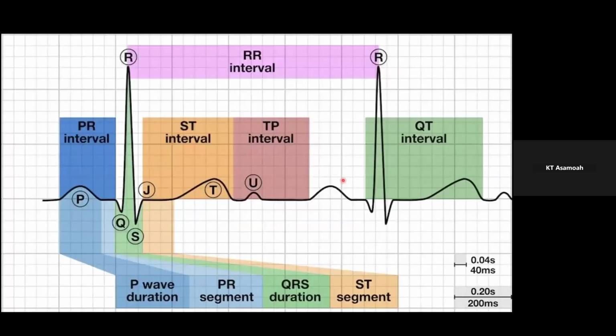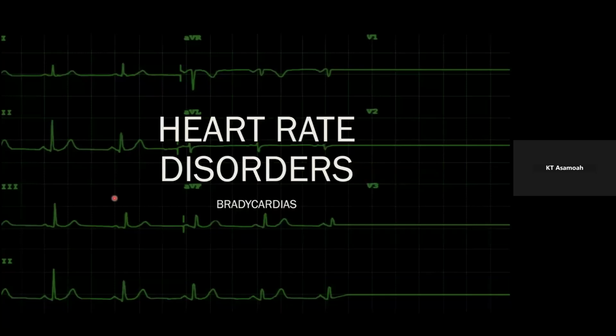And then there's a prototype ECG. I believe we all know what the intervals stand for generally. The P wave is atrial depolarization. The PR interval is from depolarization of the atrium to depolarization of the ventricle. It encompasses everything from the conduction down the internodal fibers into the AV node, down the His until it reaches the Purkinje fibers, where it stimulates depolarization of the ventricle. And then the ST segment has to do with the repolarization of the ventricle.